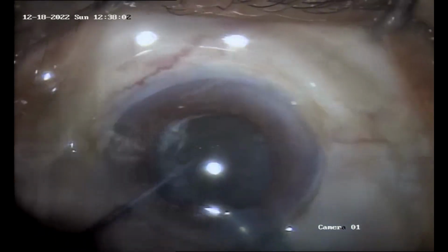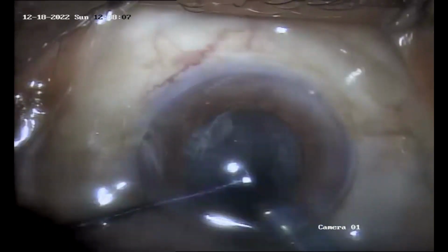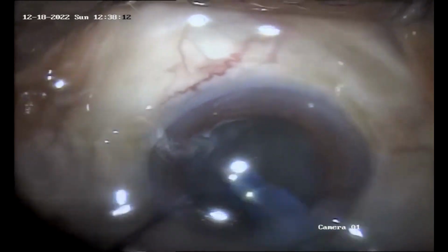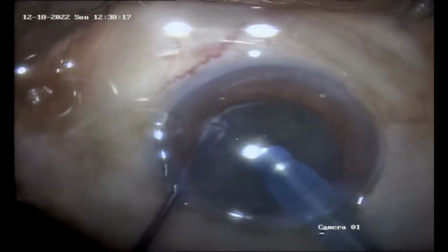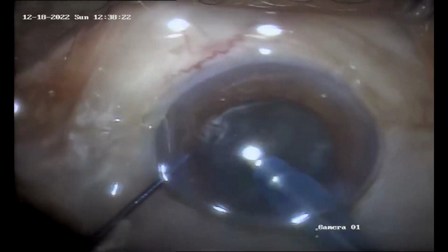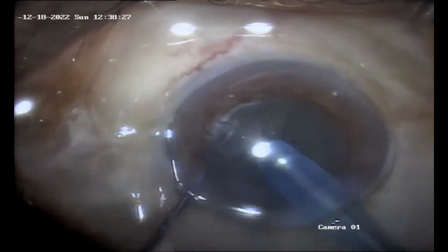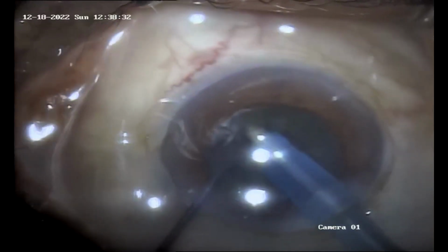The patient is young and during the phacoemulsification the pupil is a bit constricted, might be due to the excessive release of prostaglandins E2 from iris stroma due to manipulation.